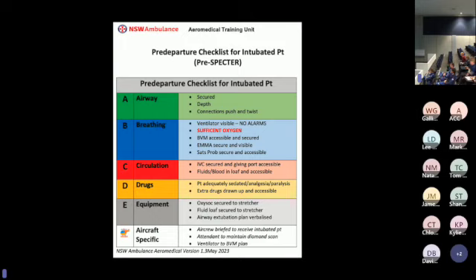We have sufficient oxygen. And so for our checklist, we're going to ensure that we're not in the red bar, the red section of the oxygen cylinder, because that's going to indicate that we have less than 200 litres of volume, okay, with the composite cylinders we use.